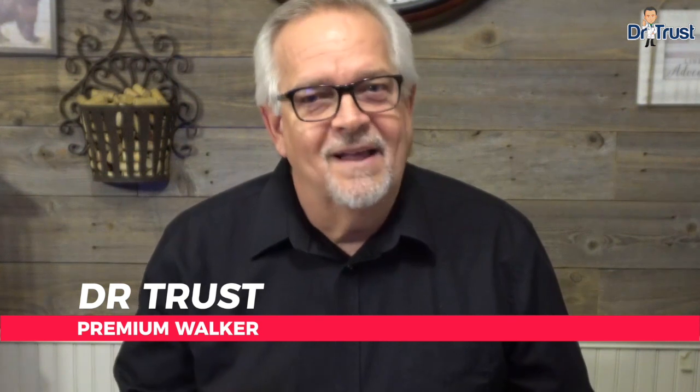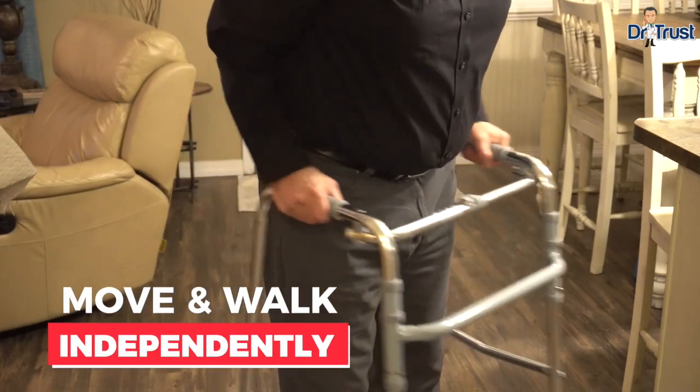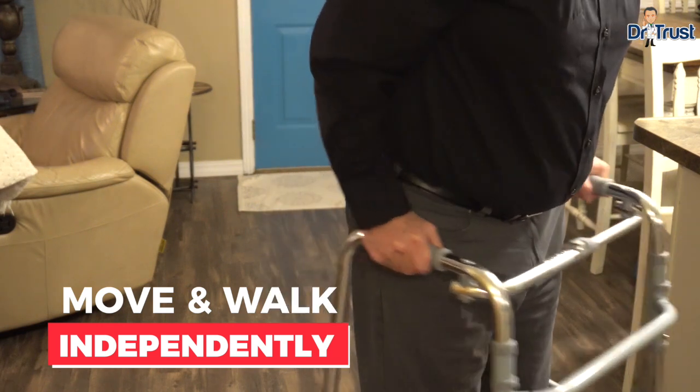If you or a loved one are in need of mobility assistance, the Dr. Trust Premium Walker can help them in moving and walking independently and aid in accommodating a more active lifestyle.